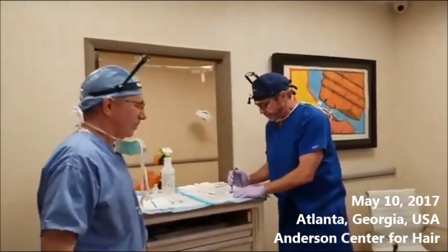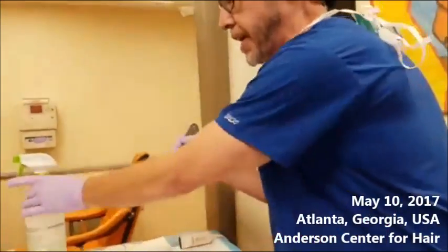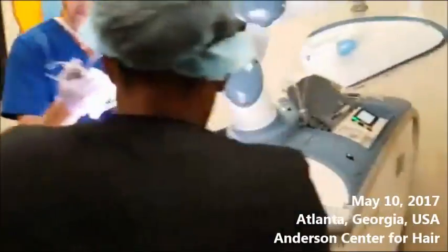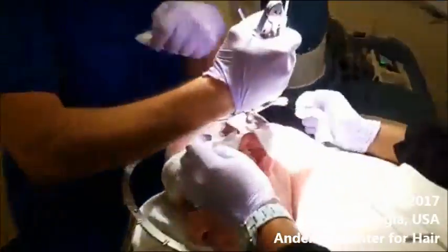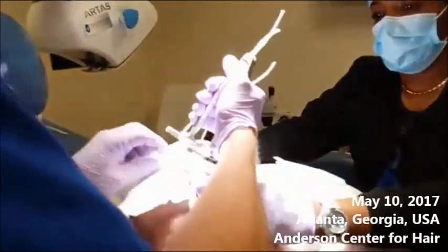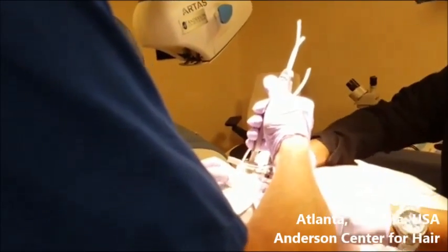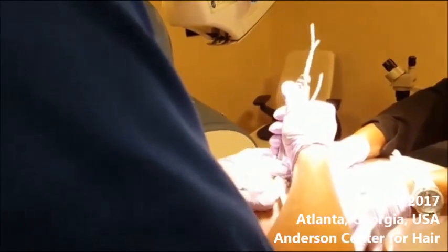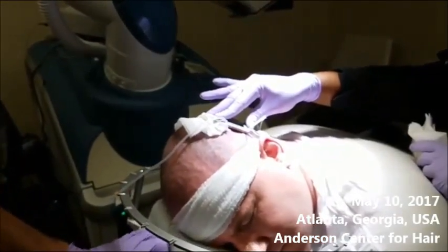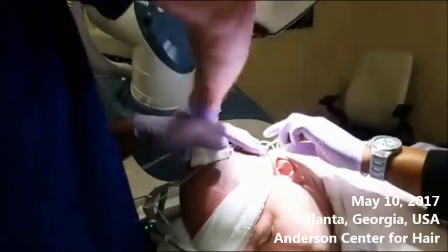So what we're going to do is take the tensioner in our hand. It's got these little tiny spikes to kind of hold on to the scalp. Now, Charles has been anesthetized and he's not going to feel this at all. We're going to place it right here. There are little spikes on here — I'm going to push them on to Charles. Does that hurt? Nope, not at all. So we're going to put a little tension on there and place the tensioner. What the tensioner does is hold the skin under significantly more tension than the surrounding skin, so that when the robot punch comes in to extract the follicle, the skin doesn't buckle and the hairs don't get transected.